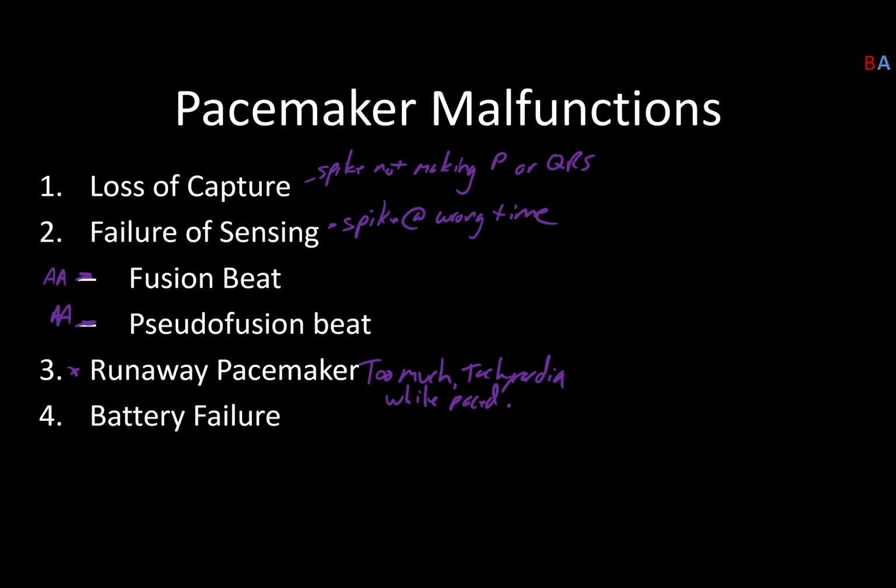Lastly, there's just battery failure. That can happen. It can wear out. Again, it's just like your phones. The more you use it, the less battery life it has. Typically, nowadays, these can last 6 to 8 years. And even if it is beginning to fail, patients with pacemakers do frequent check-ins, at least once a month.